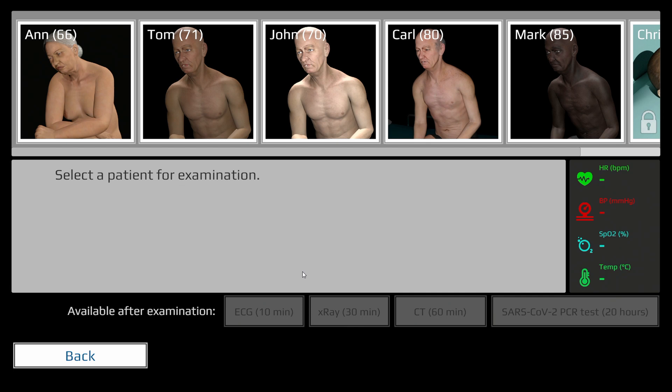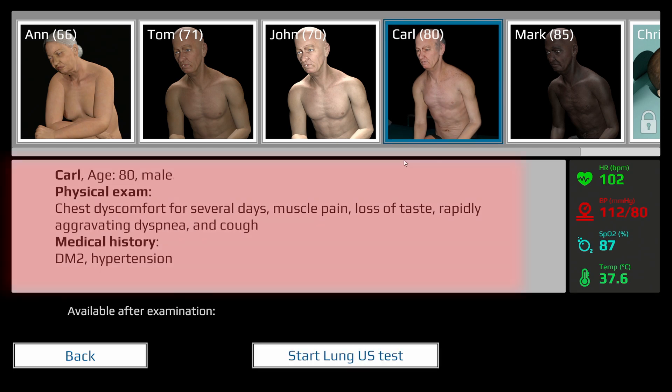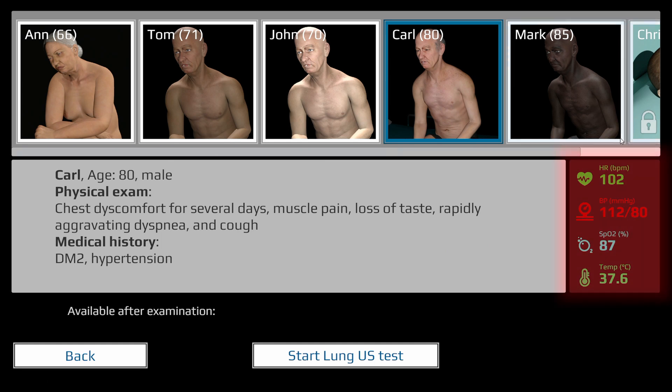You can select one of the patients, read a brief history, and look at vital parameters that may help to understand the clinical scenario.